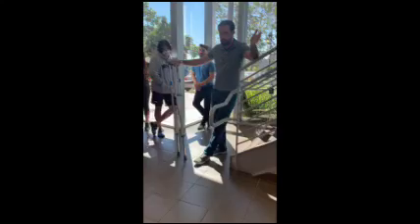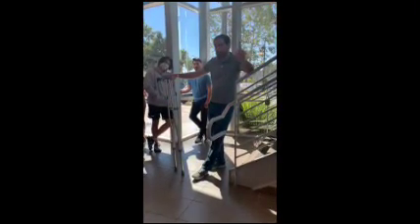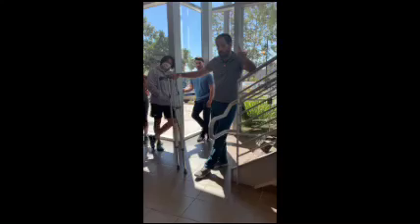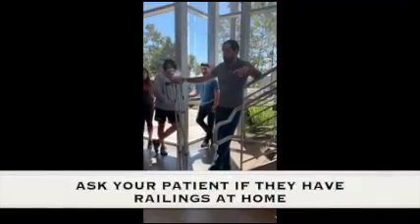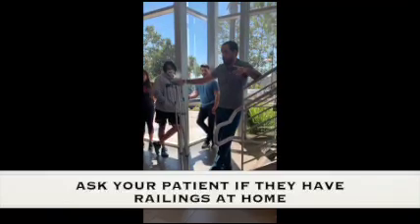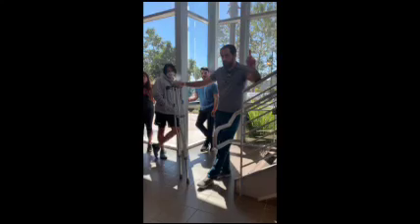Okay, so if I was teaching crutches to go up the stairs, what would I tell my patient how to do it? So the first thing actually you should do is ask your patient if they have railings at home. This is where I'm kind of a stickler, and if you don't ask your patient, then I'm probably going to tell you they only have a railing on one side. If there's a railing on both sides at home, how do you teach your patient how to go up and down the stairs?